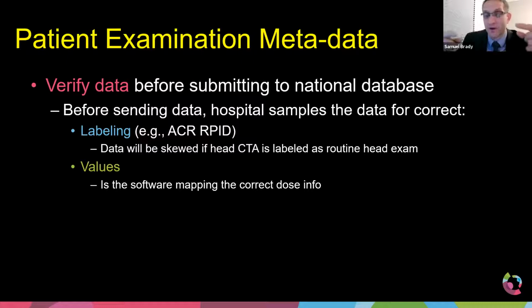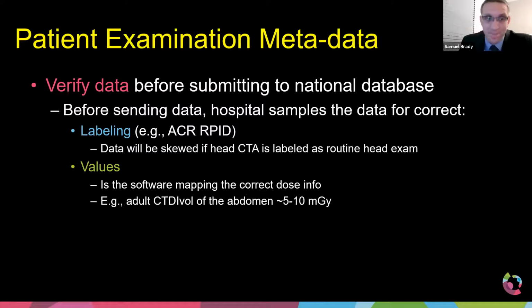And that goes back to where I said, people like your technologists or your medical physicists, if you have them, they need to make sure that the CTDIvol value is accurate on the scanner and all the other metrics that we'll talk about.